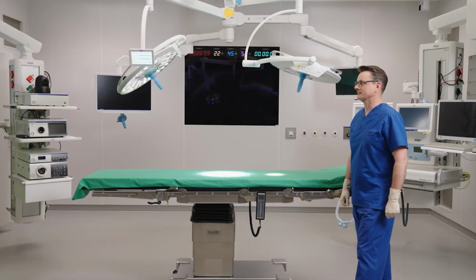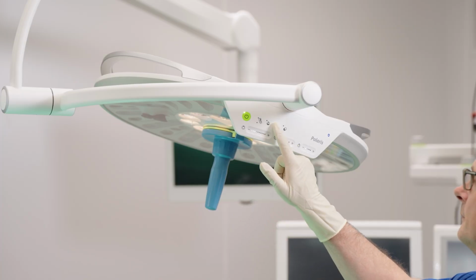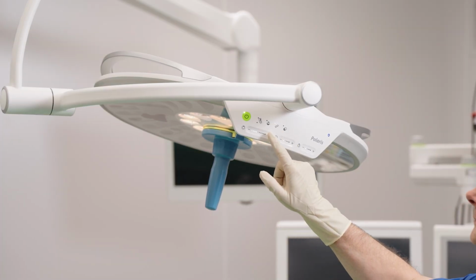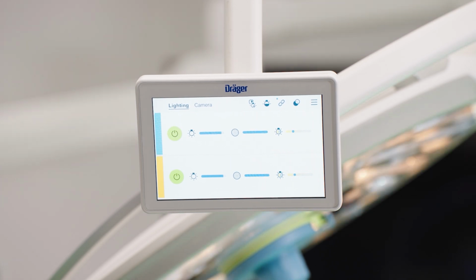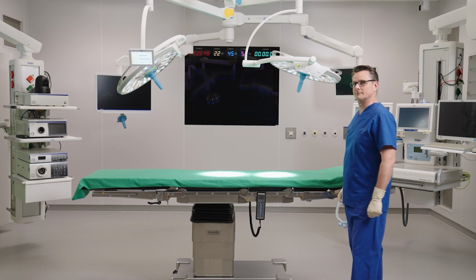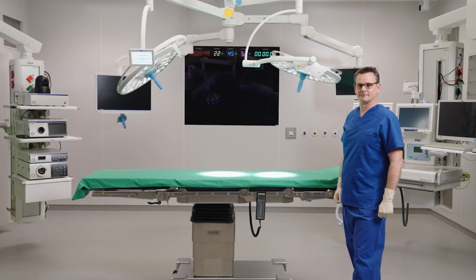When activating the sync mode, all of the system's active light heads work with the same light settings, so that the light heads can be controlled simultaneously with one control panel. The following features can be synchronized: light intensity, color temperature, light field diameter, endolight, and anti-glare mode.